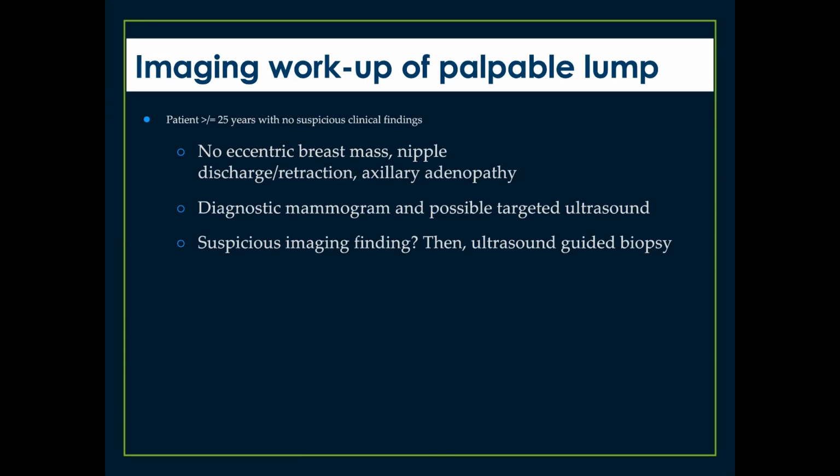If the patient is 25 years or older, again with no suspicious clinical findings, then we would start with a diagnostic mammogram and consider targeted ultrasound. As we saw earlier, perhaps it's just merely pseudogynecomastia or something else that's benign. But if there's any doubt, we can certainly do a targeted ultrasound. And if there are suspicious findings, then recommend an ultrasound guided needle biopsy.